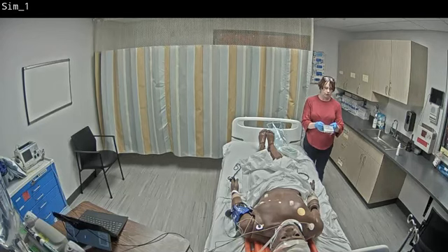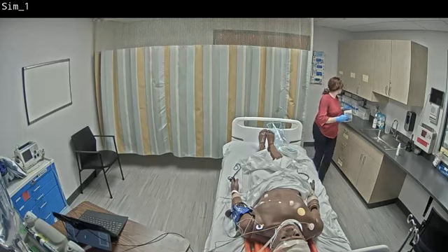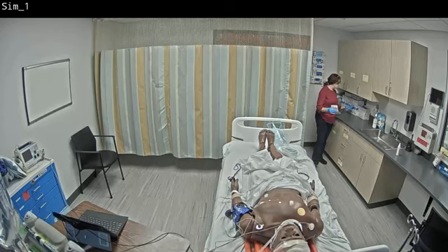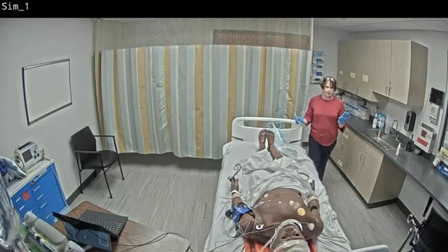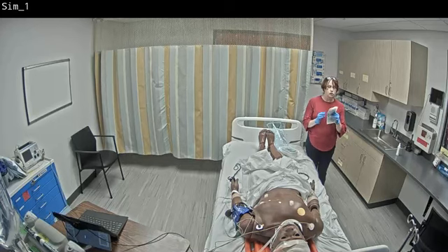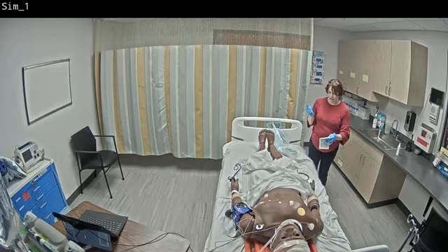These are nitrile gloves, and because they are for catheter use, these are sized small, medium, large, extra large. These are not sized like your 7, 7.5, 8, 8.5 sterile gloves. So when you use these, size up. So if you would use a small, go up to a medium. That might make it easier to get the gloves on.